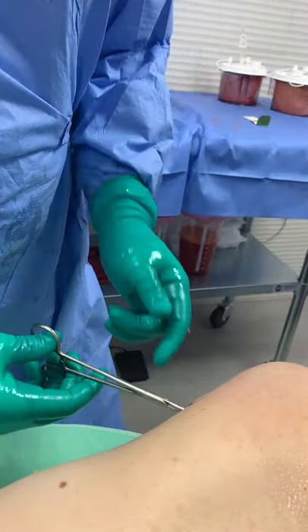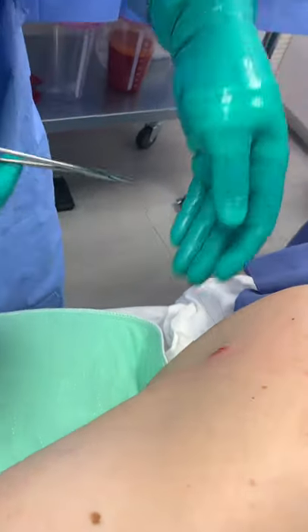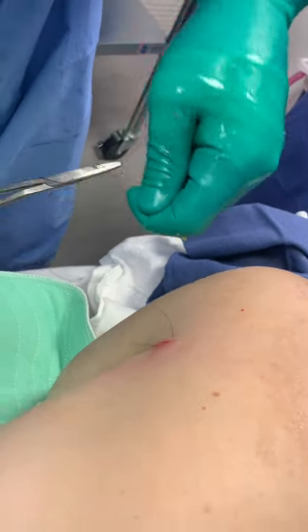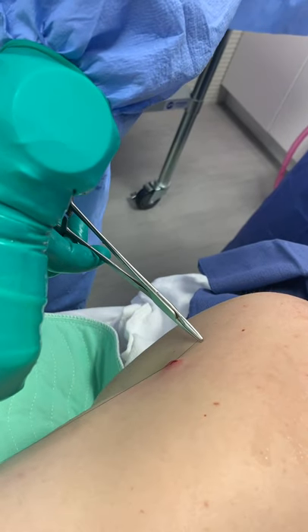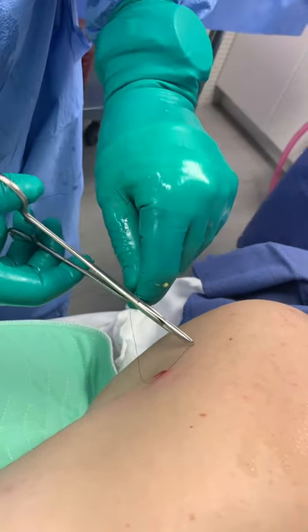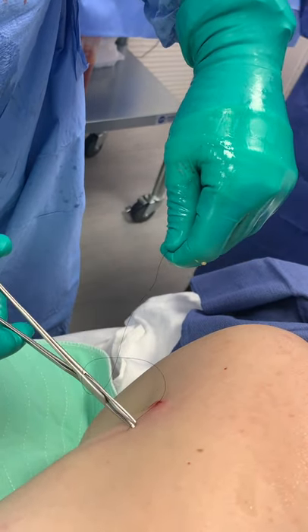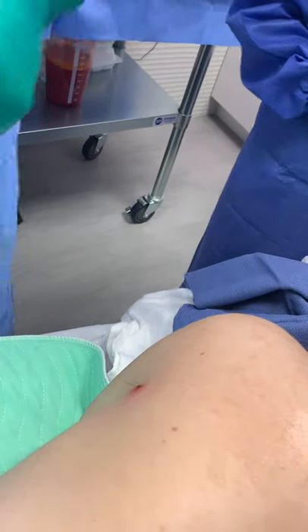Just doing a little suturing here. This is the size of the hole. You can see it over here if you come over this way. That's the size of the hole. It's about 3 millimeters in length. And I put a single suture, just not very tight, just to approximate it. And she'll get these taken out in 10 days, 10 to 14 days.